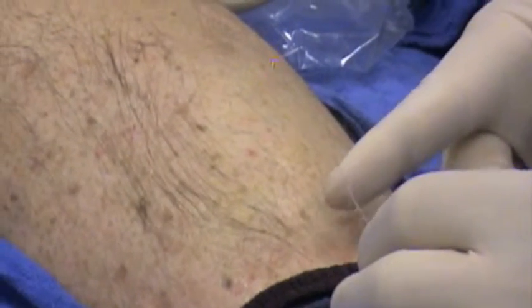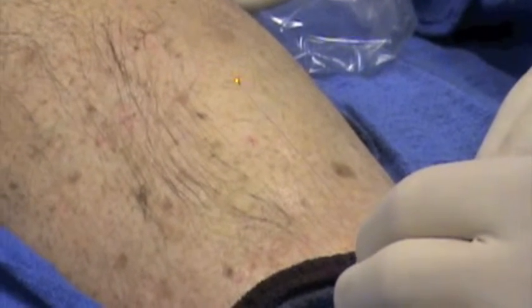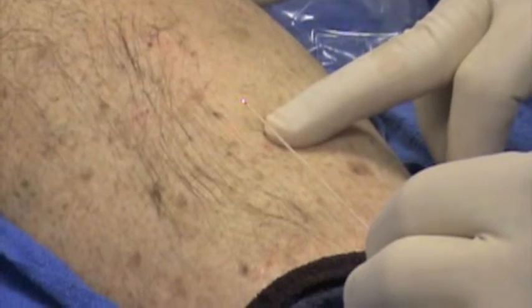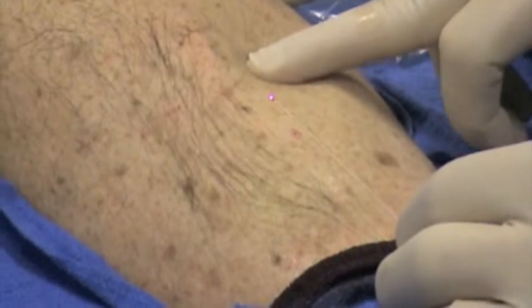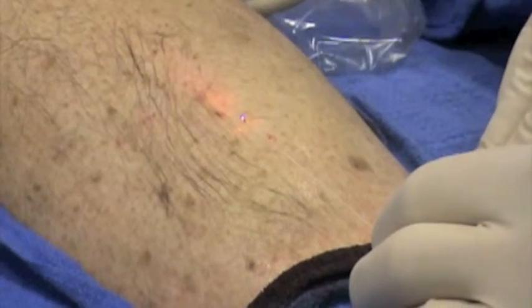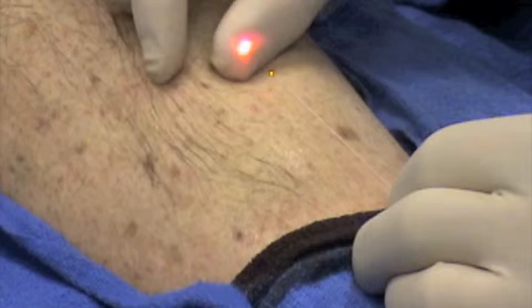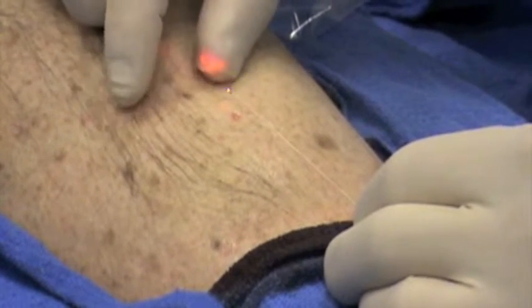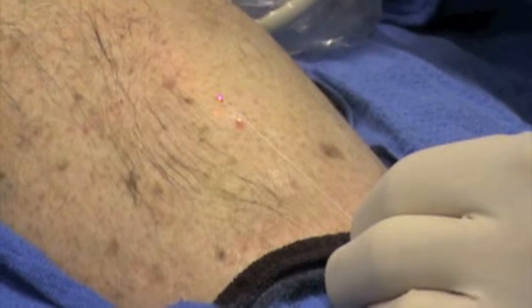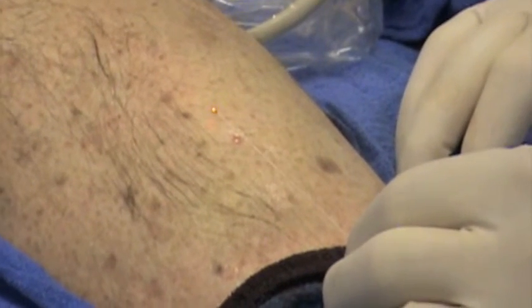We're done. You can see this is the laser filament we used — we went through a 16-gauge angio-cath. You can also use an 18-gauge needle, but be aware of hub size when threading laser filaments. Once the laser filament was in place, we injected the foam, then tumescent around the area — you can see the laser light to confirm positioning — and then we fired the laser. You can see a little char on the tip. For that distance, you get heat damage, and we also did foam, so we had double injury: chemical and heat. Afterwards, we'll check the popliteal vein to make sure the foam has cleared, which it usually does after tumescence. There's usually not much foam that gets into the deep circuit.